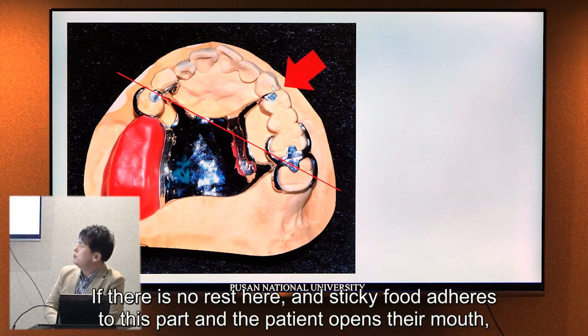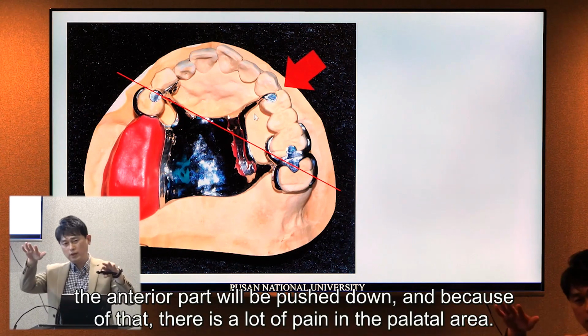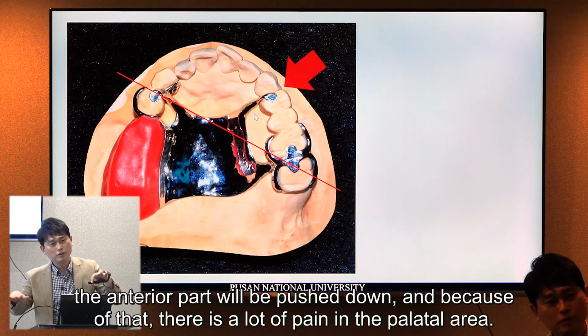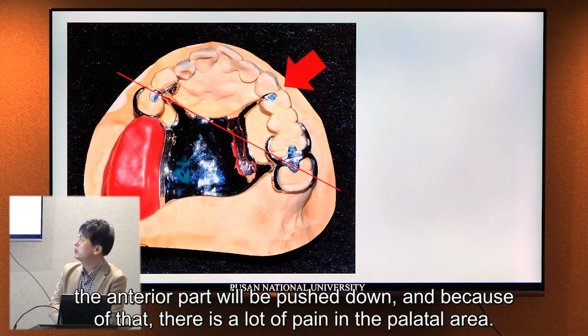Let's imagine there is no rest here, and then sticky food adheres in this part, and then the patient opens the mouth. At that time, the anterior part will be pushed down, right? Because of that, there is so much hurt in the palatal area.